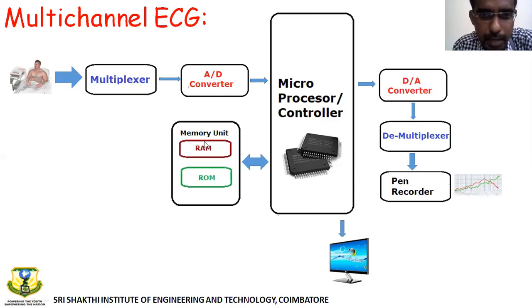Especially memory, there are 2 types of memory. One is ROM, the green color, and the other one is RAM, the brown color. ROM is read only memory. This is where the operating system is stored. Any equipment, right from mobile cell phones, has an operating system. It needs to turn on, boot and do its operation automatically, unless otherwise we tend to change it. So the operating system is stored in ROM, read only memory.